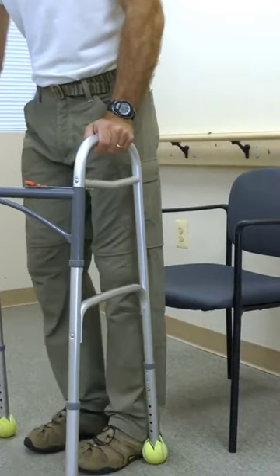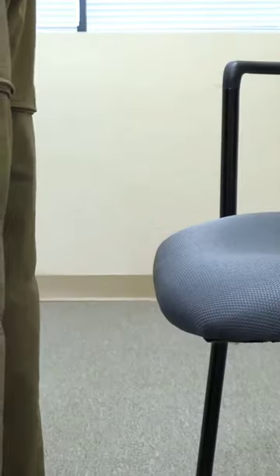Scoot up to the chair by taking baby steps around — do not pivot. Back up to the chair and feel the chair with the back of your legs.